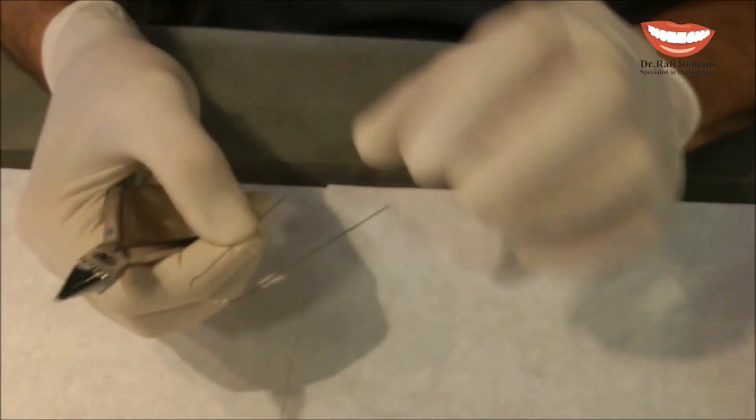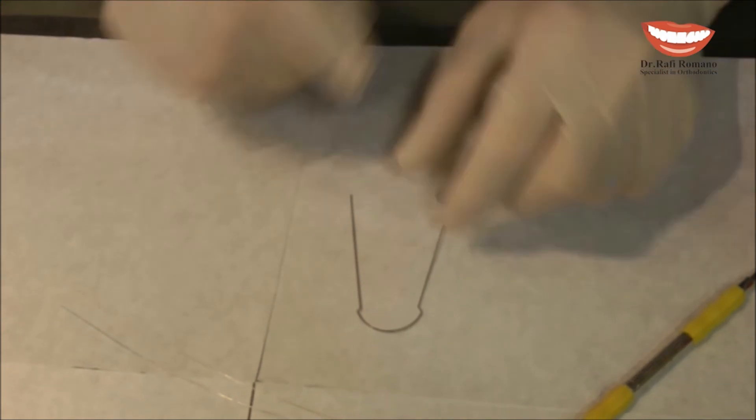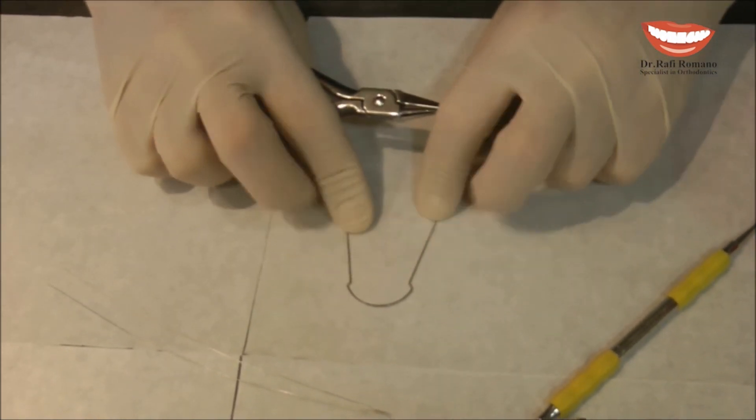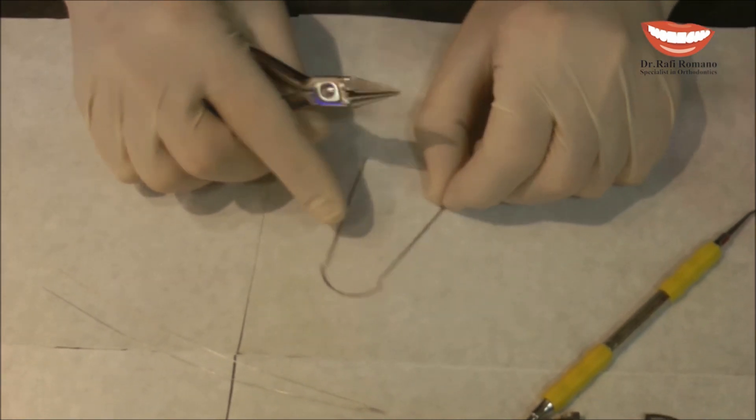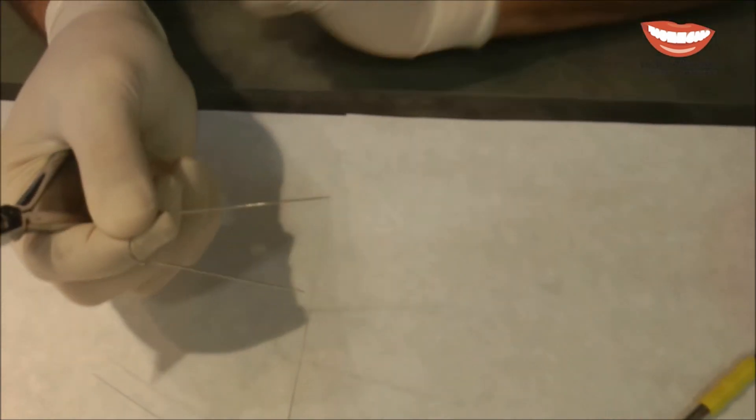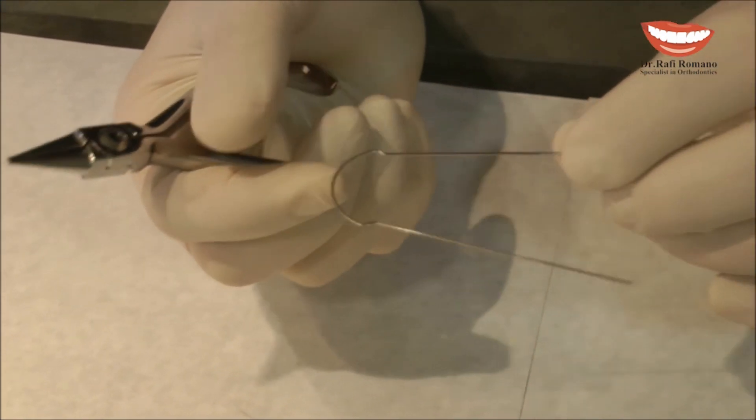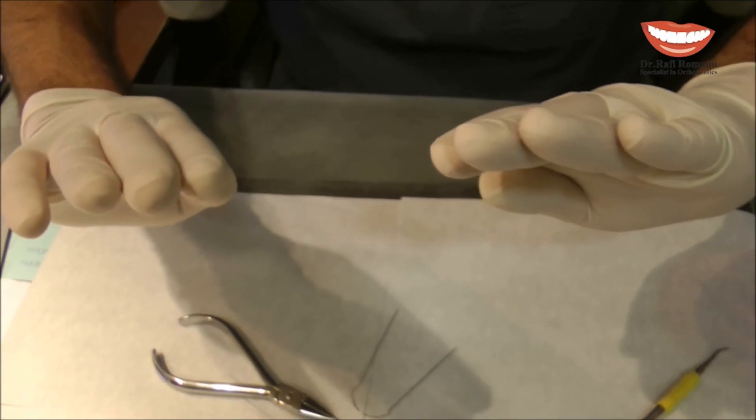I check the wire to see that it is passive. And I have the mushroom bands and now I will show you how we make the compensation for the bowing effect when we close the space.